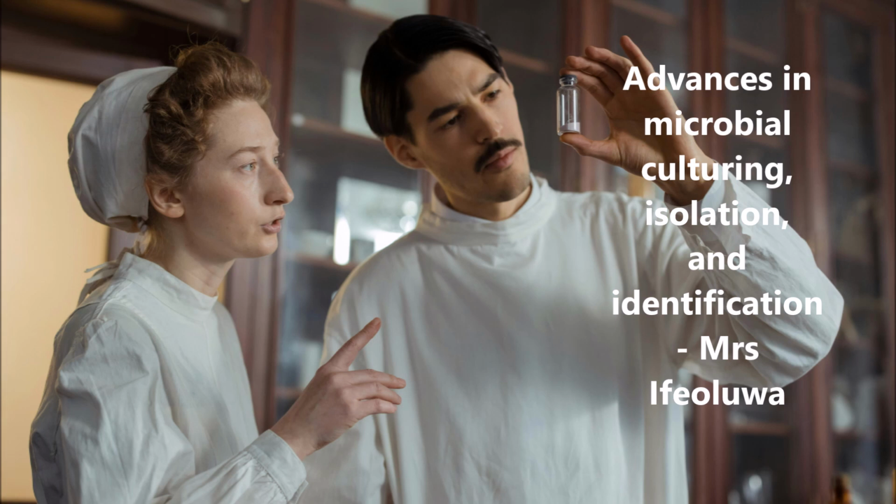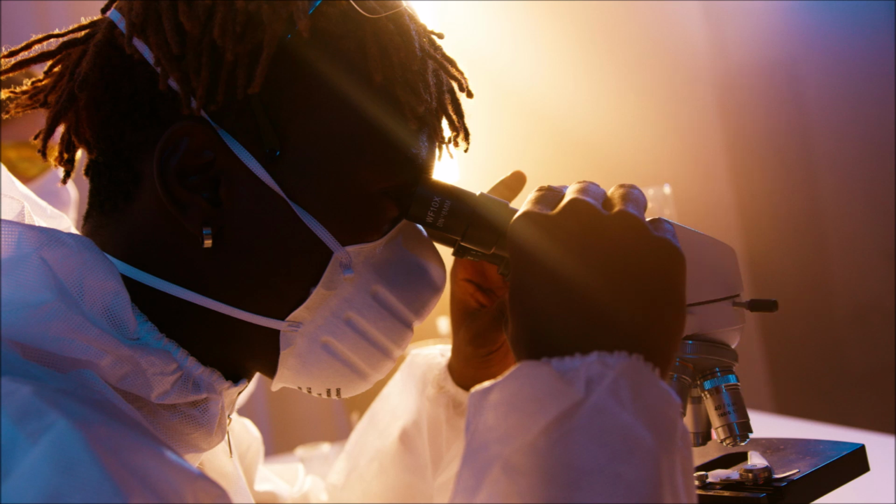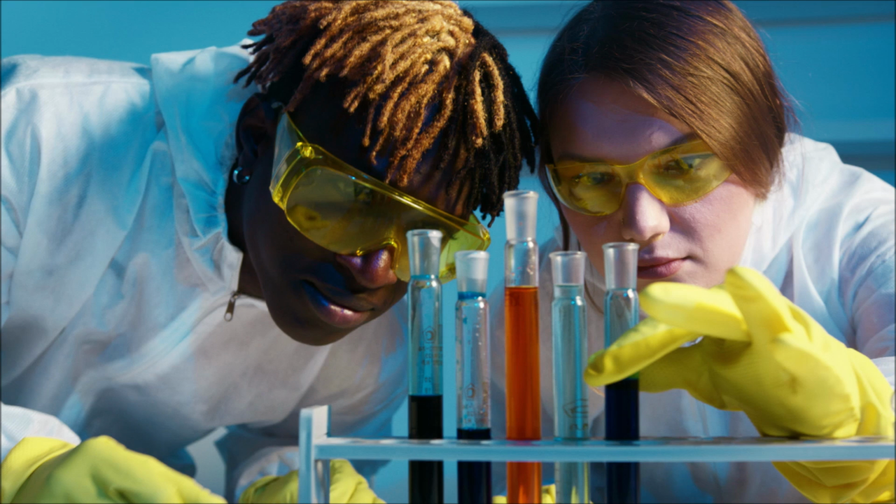It enables fast and precise microbial detection, including pathogen identification in clinical and environmental samples. Then AI and machine learning in identification. Automated analysis of sequencing and imaging data improves accuracy and reduces human error. That is, when we use machines, it also makes our work faster and reduces human error. So here is an image of the MALDI-TOF machinery.